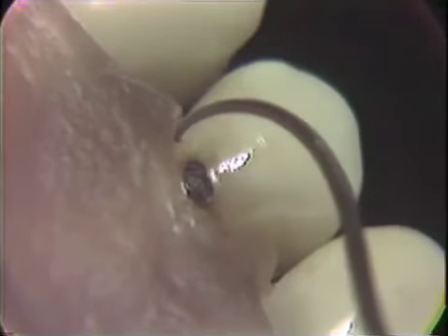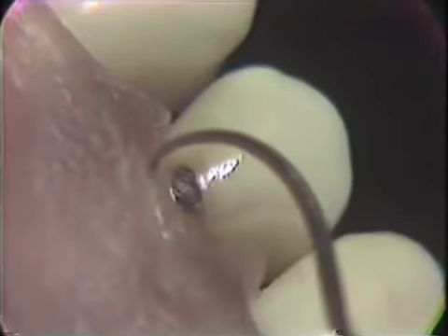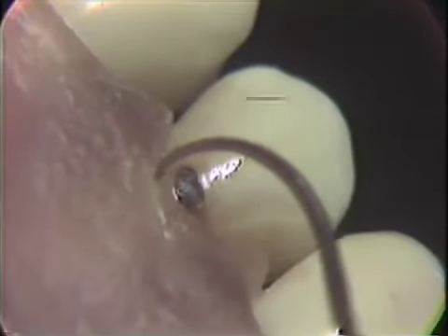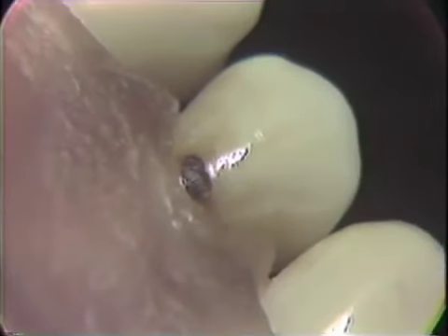On the mesial aspect, the plane of occlusion line again being followed just subgingivally, then an angle formed, again forming this trapezoid in a straight line carrying across to the distal cervical aspect.